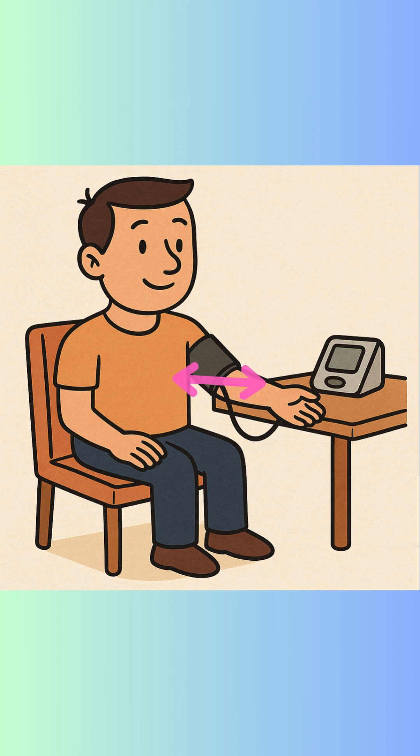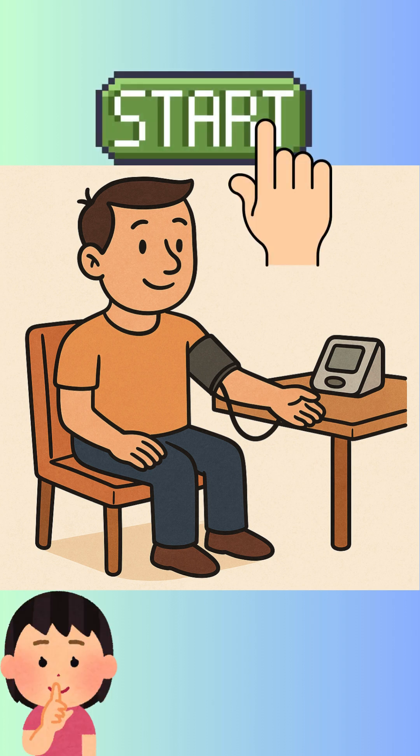Step three: wrap the cuff snugly about one inch (2.5 centimeters) above your elbow. Start the monitor and remain still and silent.